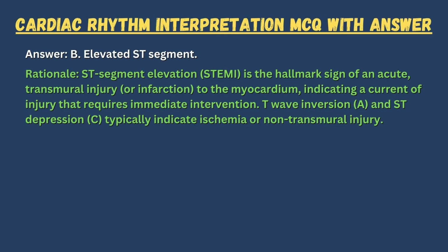Rationale. ST segment elevation, STEMI, is the hallmark sign of an acute transmural injury or infarction to the myocardium, indicating a current of injury that requires immediate intervention. T-wave inversion, A, and ST depression, C, typically indicate ischemia or non-transmural injury.